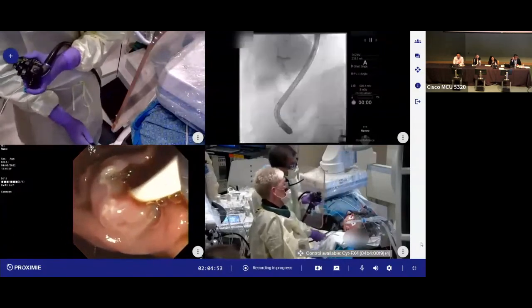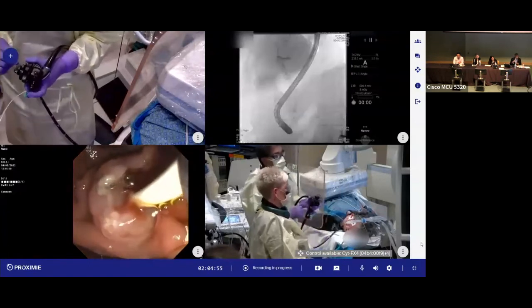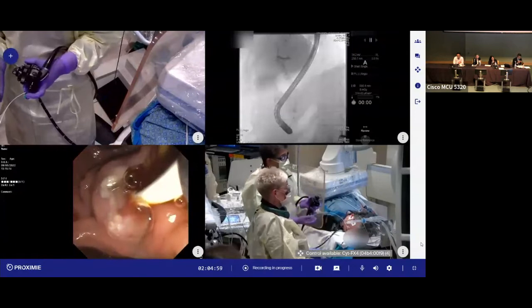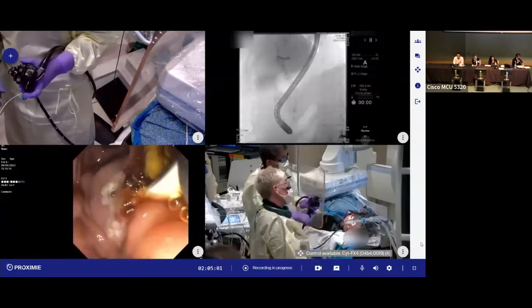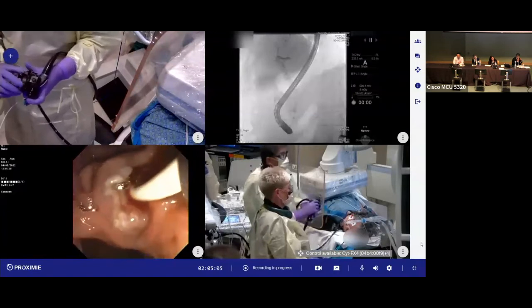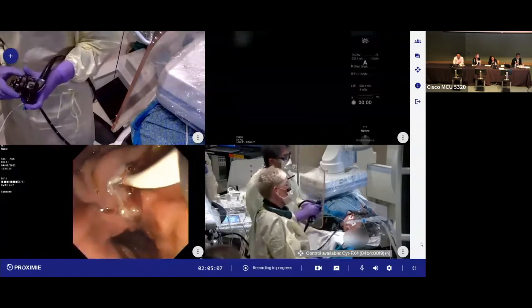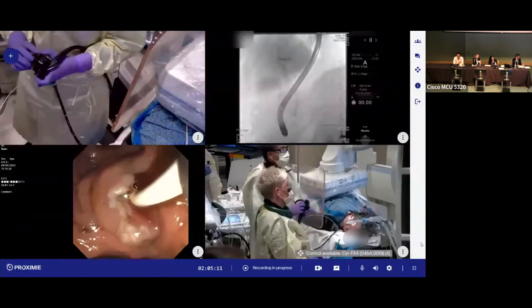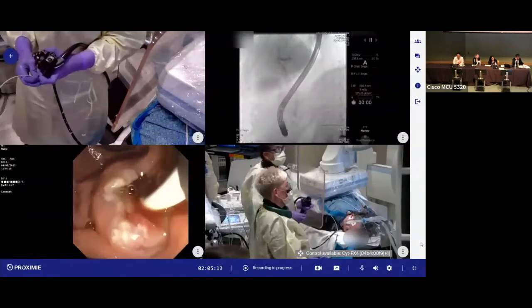And the best way to do that, and do you notice on this fluoro view about the posterior part of the duodenoscope, so that the dorsal part of the duodenoscope is right up against the duodenal wall. If you look away, you are digging into that duodenal wall. You don't want to look away and do this maneuver. You want to get closer with the big wheel.